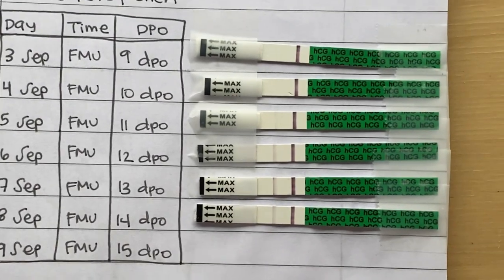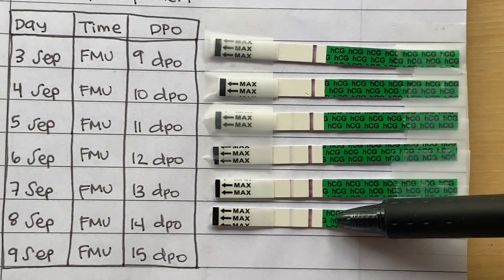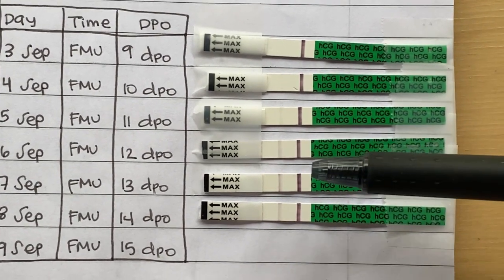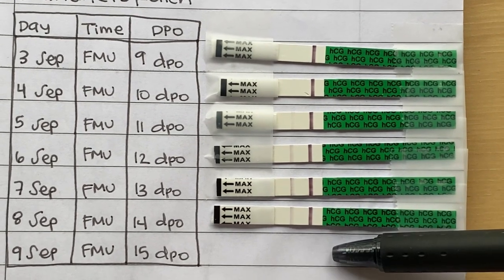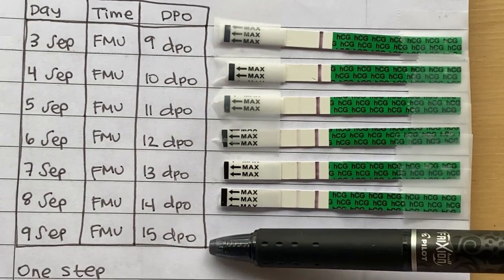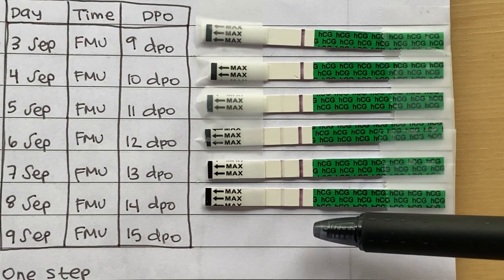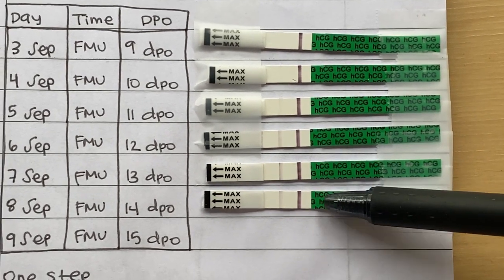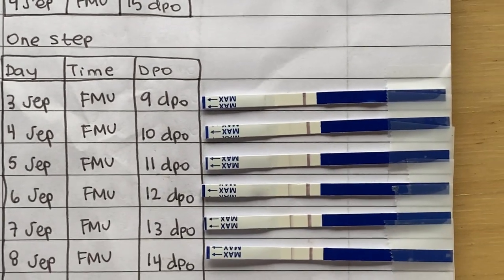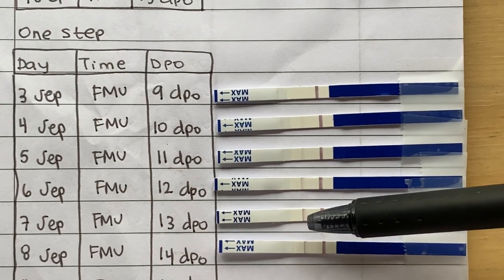I did not take a second morning urine test, so this is my first morning urine test, and you can see this line is obviously lighter than that line from yesterday. I just don't want to waste. Yeah, it looks like I only have one more left. I only have one more of the green handle test left, and I just don't want to waste it right now. I want to wait until tomorrow. So we'll just have to wait and see and trust that it was because my urine sample this morning was diluted.